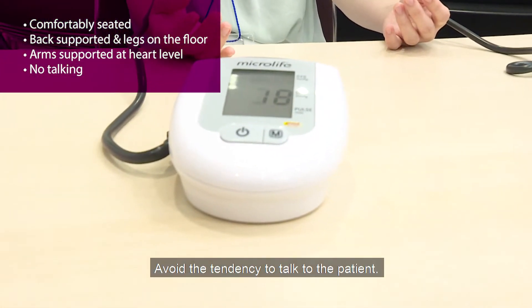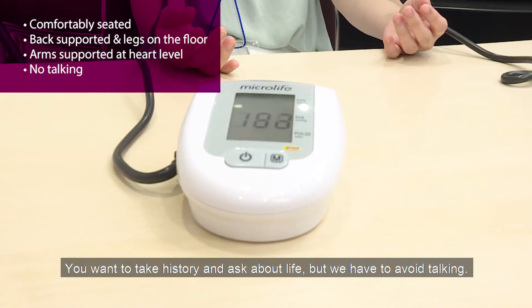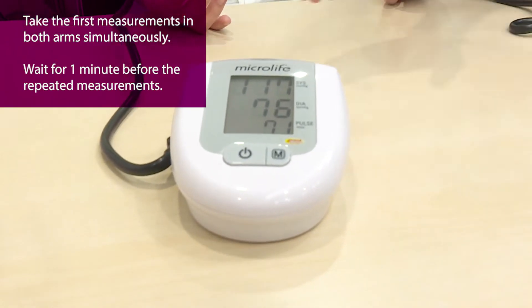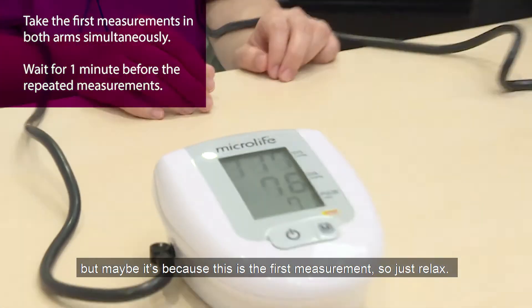You're always so tempted to talk to the patient — you want to take a history, you want to ask about life — but we have to avoid talking. So there is some difference between the left and right, but it might be because it's the first measurement.